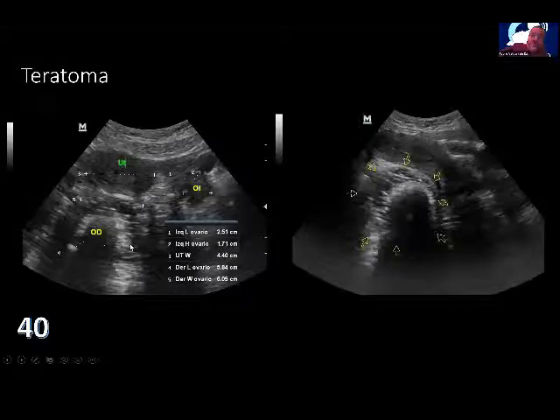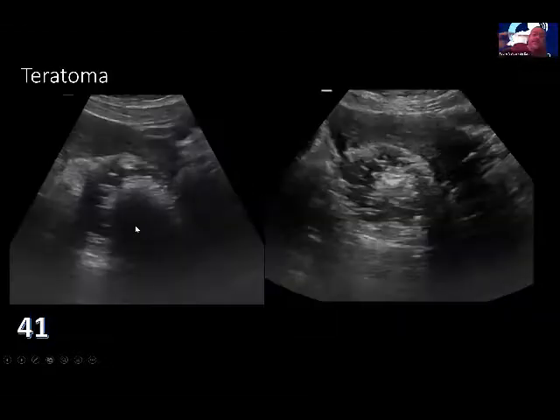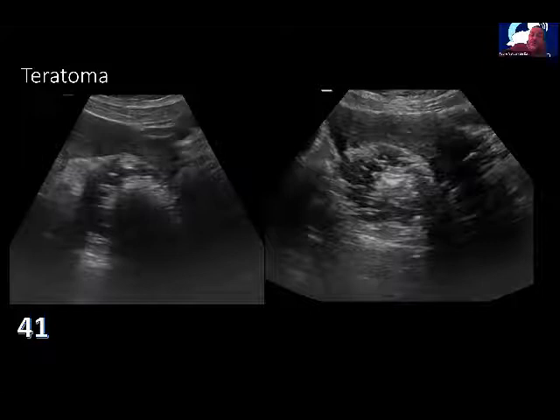If you perform obstetrical ultrasound, you can see this over the head of the baby. This is a right-sided complex cystic mass with a normal left ovary, uterus. And I can bet this is hair. See that? That is hardly going to be anything other than a teratoma. This is a teratoma.